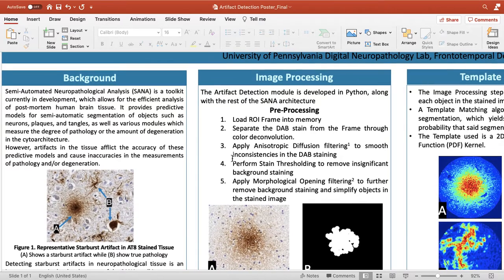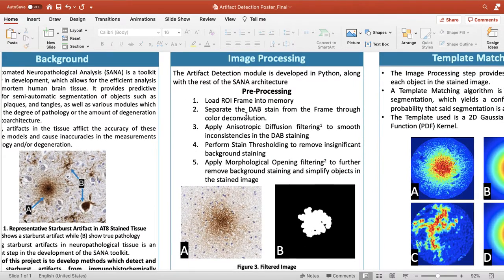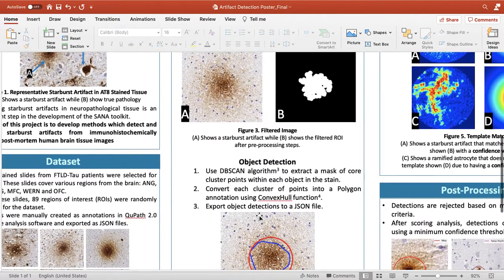And for our image processing, our first steps were the pre-processing ones, where we separated the DAB stain and used various filters, including the anisotropic diffusion and morphological opening filter, to be able to better detect the artifact. And we also perform a stain thresholding to remove insignificant background staining.